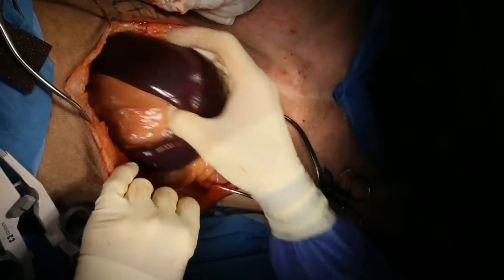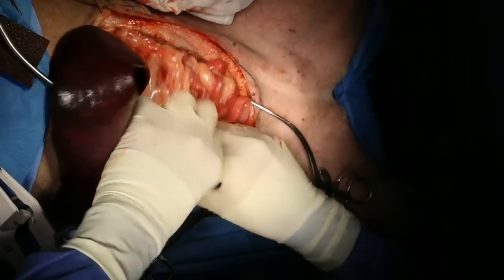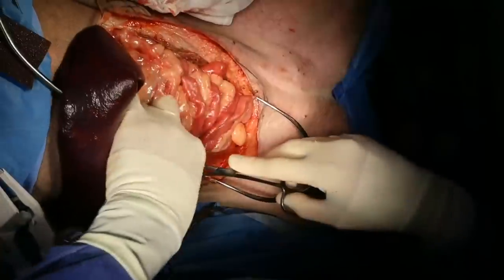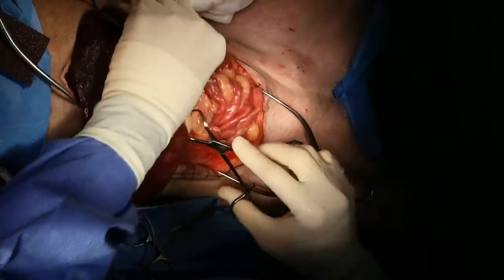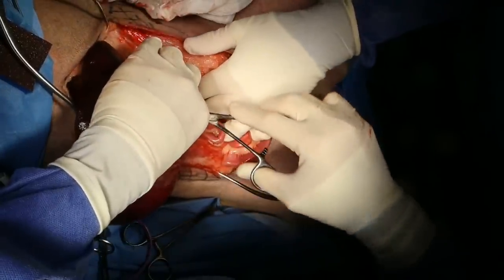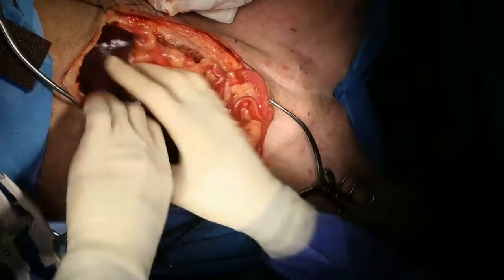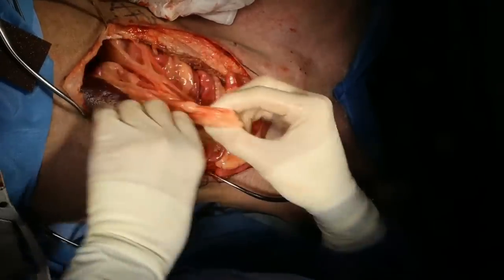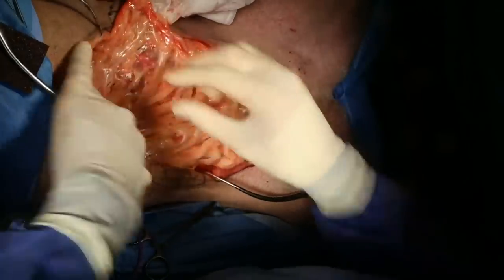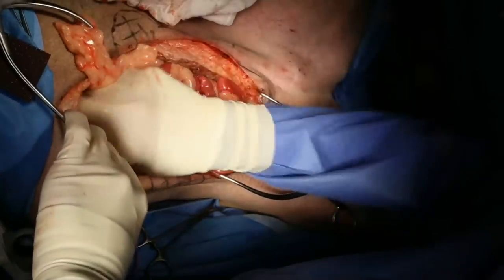So Yui, just so you know, when you lose abdominal domain, which means that you don't have enough volume space in the abdomen to close, you can take the spleen out. So that would close under duress. So I think I'm just going to do a polypropylene mesh. I find that they're more comfortable when you do a mesh anyway. And there's not a real disadvantage to it. Theoretically, it could get infected or whatever.